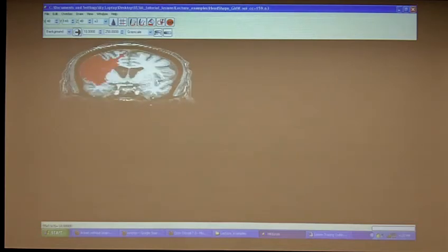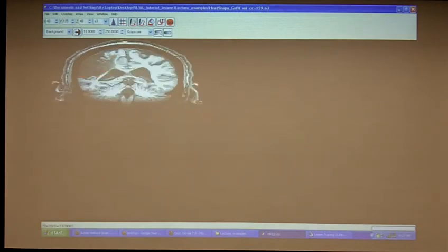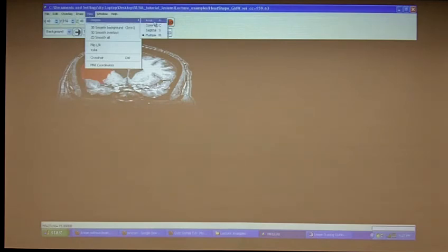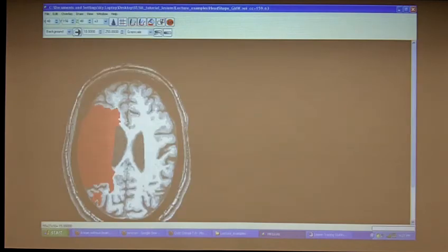You want to make sure you're staying inside the dura on the medial side of the brain, and also that you're not going into the ventricle here, because that's just fluid. There's no processing going on there. So you go through and make sure you're within your boundaries, and then you think, yay, I'm done, but you're not. You have to go back again to the axial and check all of these little things. You can see I deleted two things here. Well, that really should be this whole thing here.